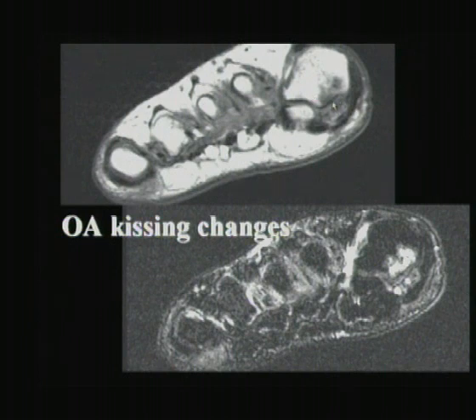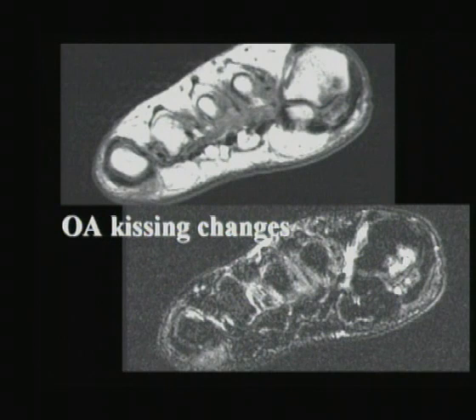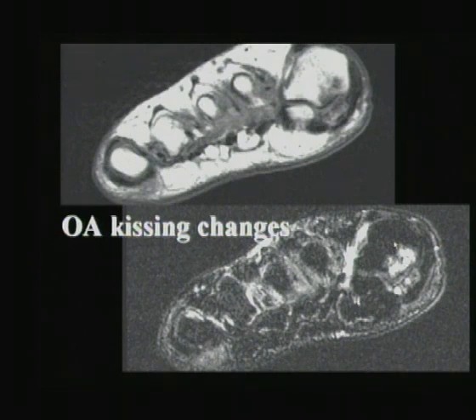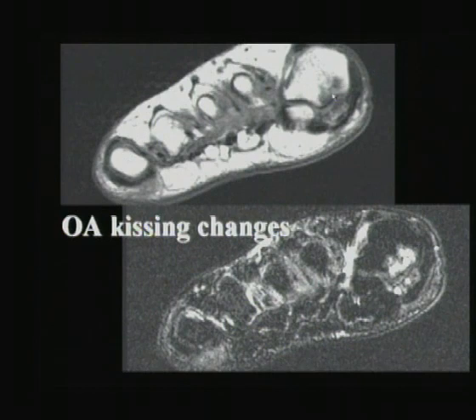Here is another important point about the sesamoids. The fibular sesamoid shows little to no normal marrow signal on T1, suggesting AVN or severe marrow edema, confirmed by marrow edema on inversion recovery. What makes this diagnosis is the kissing changes in the adjacent metatarsal head. The majority of mistakes I've seen in the sesamoids is over-calling a sesamoid disorder that is really articular disease — and all this is is articular disease, confirmed by the kissing changes.